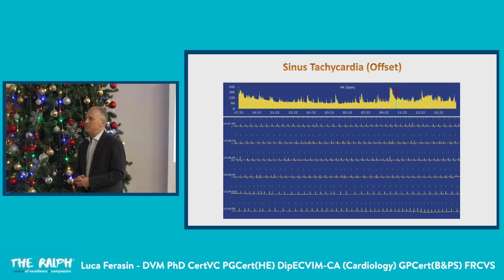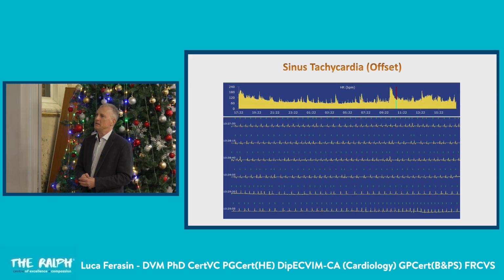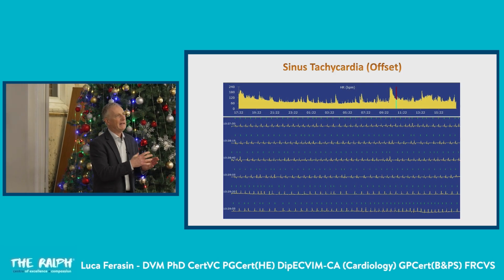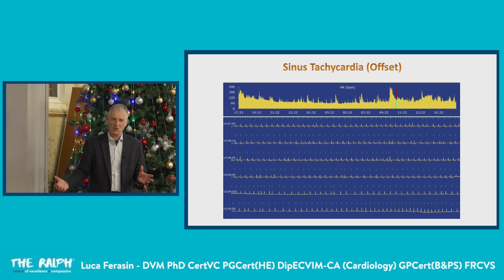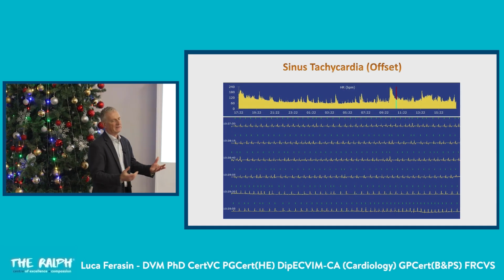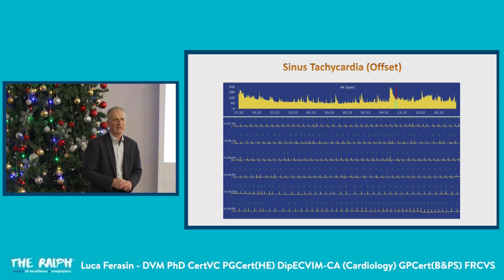Why do I say that? Because if we are listening or we are recording ECG, and we are lucky, and we make a diagnosis of tachycardia, we're lucky to see these changes that are gentle and progressive, then we can make a diagnosis of sinus tachycardia, even without a Holter. But sometimes we do need a Holter to clarify this question.